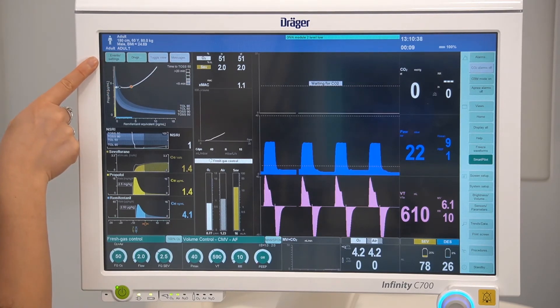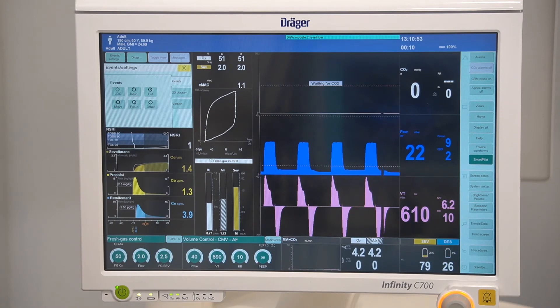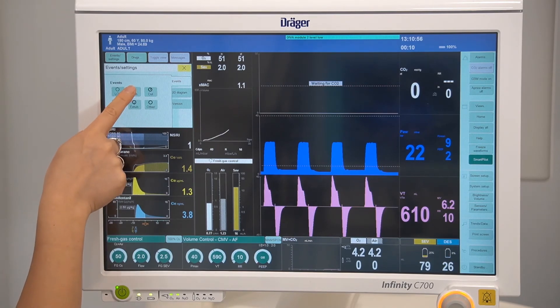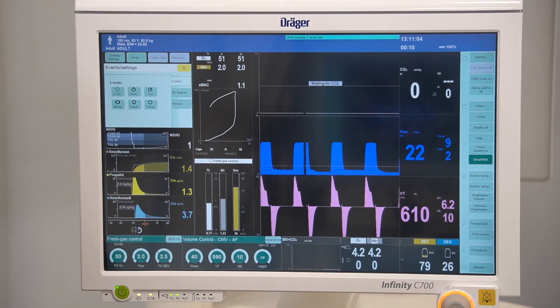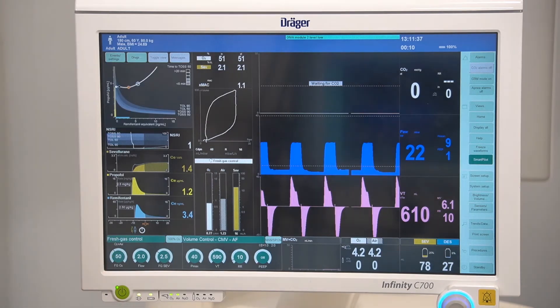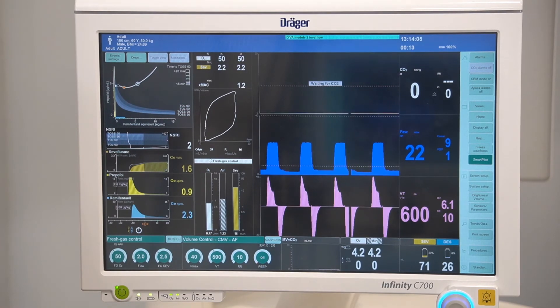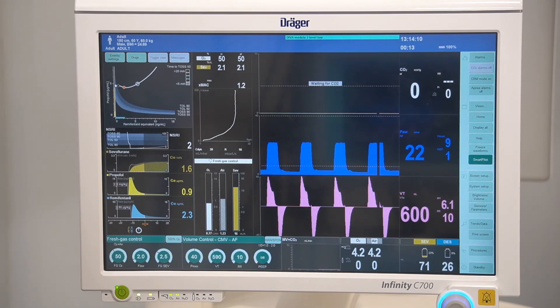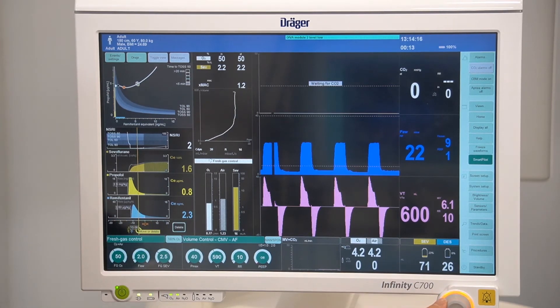By tapping on event settings, you can enter an event. For example, to mark intubation, select intubate, use the rotary knob to mark the time of the event, and confirm. You'll see the intubation icon stamped onto the time scale, and you can also see the intubation icon displayed on the isobal chart. You also have the option to adjust the manually inputted information by selecting the desired icon, which will then allow you to alter the time.